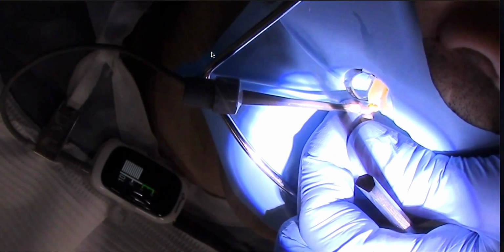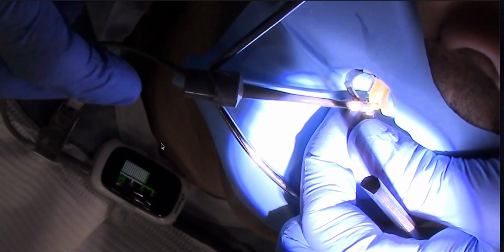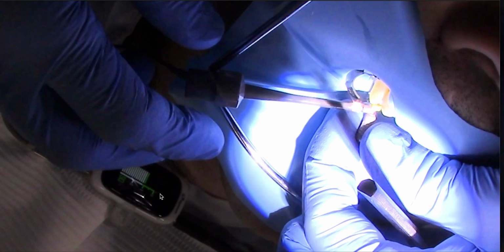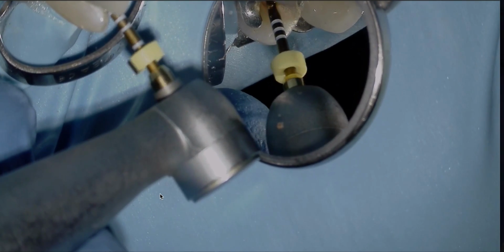I was able to get my working length, and using this really cool, I've been using this for 3 months now, and it is amazing. It goes right here, this 18th Airpex. They sent it to me to trial, and I've changed the apex locators I've used, and I've compared this with the gold standard, the Root ZX2 and the Root ZX. It's the same point. This is actually a hair longer than what Dr. Ricucci has talked about, and I've used that now in my cases, and I absolutely love it.